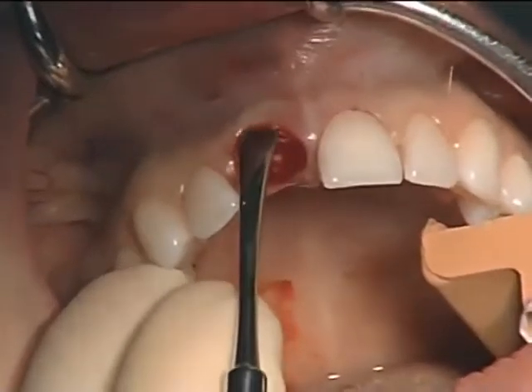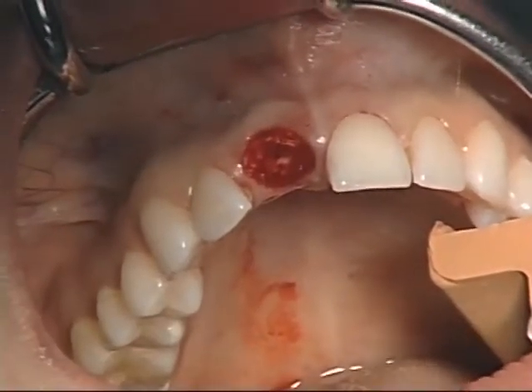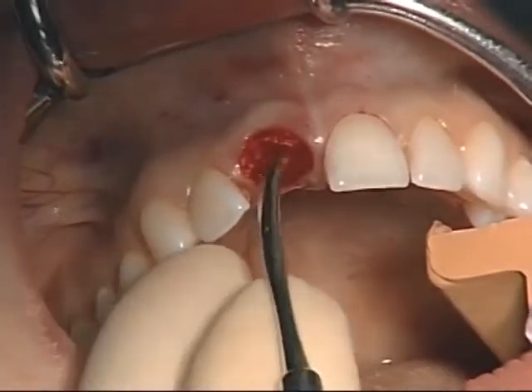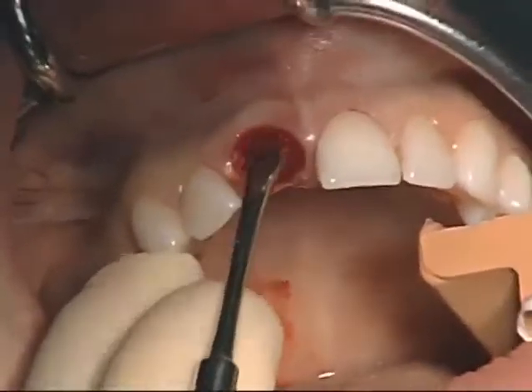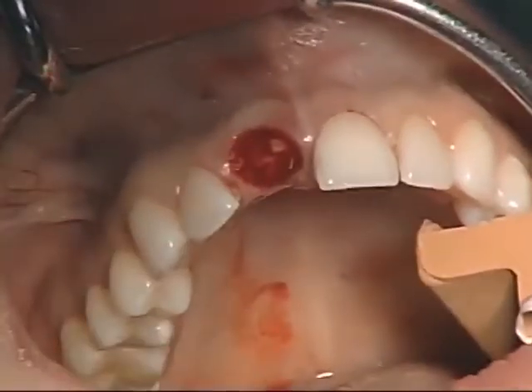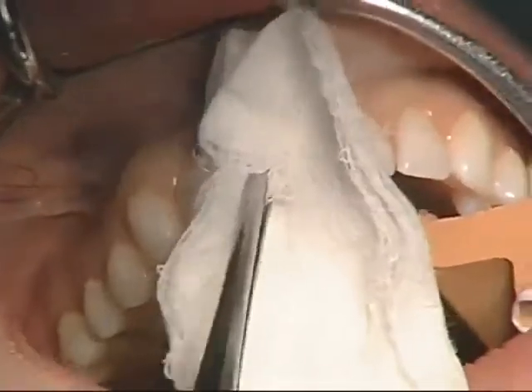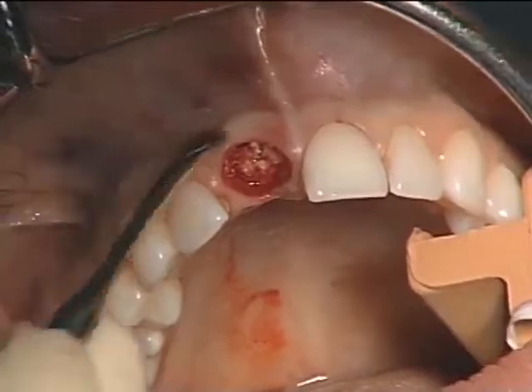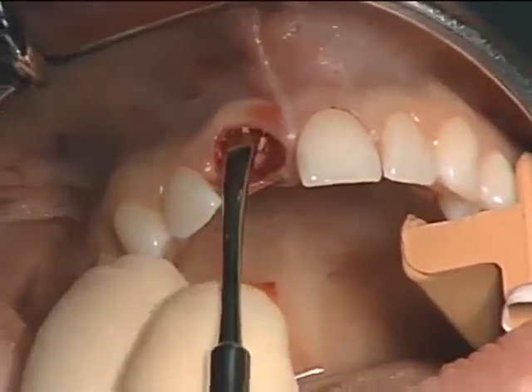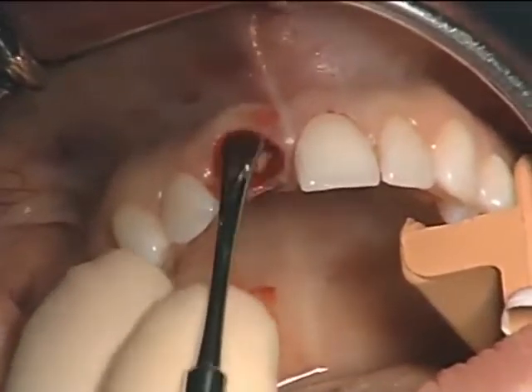And you can see from condensation, we're now putting it into that second level between the buccal plate and the tissue itself. And you can see the little plumping out of the buccal portion that creates. Now, it's very important to remember biotypes of tissue, thin versus thick. This patient has a very thick biotype tissue, which will easily allow for this type of procedure to be done. In the more thin biotype of tissue, you have to be careful not to tear the buccal tissue. Sometimes grafting might be necessary prior to doing that.